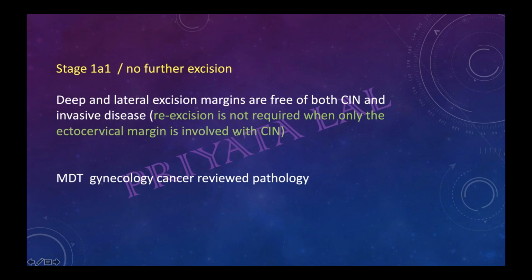Okay, hysterectomy and all. Usually this type of conservative treatment is only done for patients who are looking for fertility. I think it is a treatment also, therapeutic and diagnostic both, no, ma'am? Yeah, it is both. So what they are saying is, if you have done excision for any patient, I think we just have to follow up.